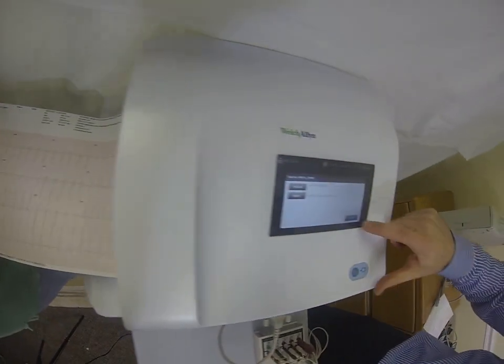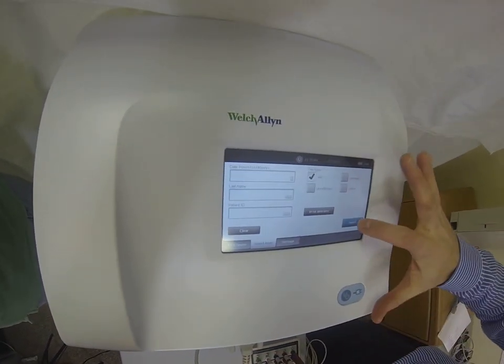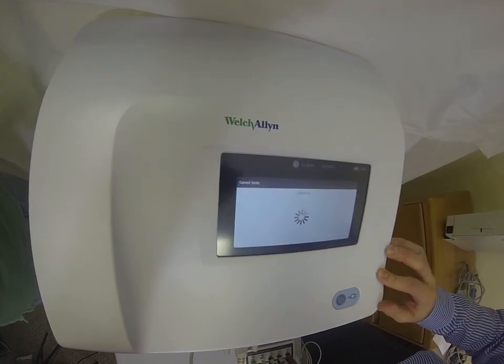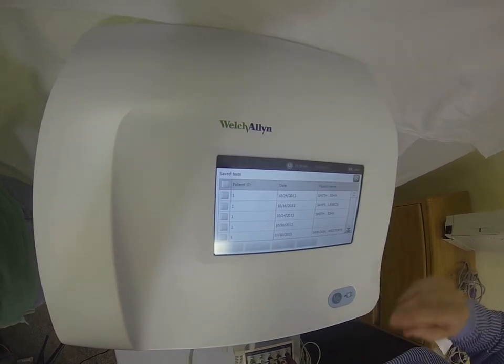Another nice feature about this machine is that you can recall tests. This will save up to 100 ECG tests, so if you ever want to go back and find an existing test, you've got the ability to do that.